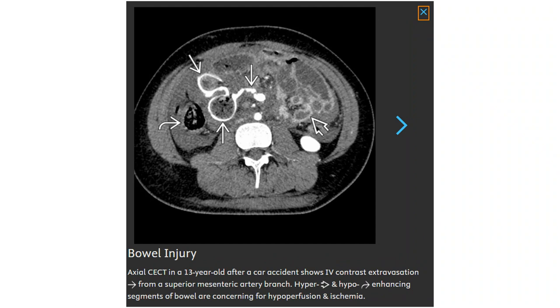Contrast-enhanced CT in a 16-year-old after a car accident showing IV contrast extravasation from a superior mesenteric artery branch, with hyper- and hypo-enhancing segments of bowel concerning for hypoperfusion and ischemia.